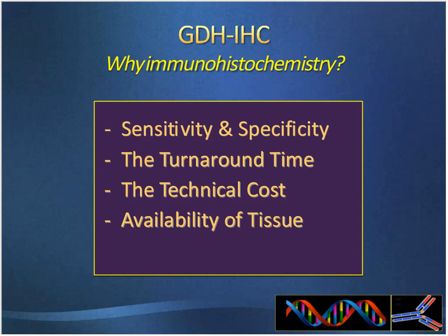I'd like to finalize this talk by telling you why we do immunohistochemistry as opposed to molecular techniques, where most of these abnormalities are actually genomic abnormalities. First of all, similar to molecular techniques used for differential diagnosis of these tumors, the genomic abnormalities are also shared.